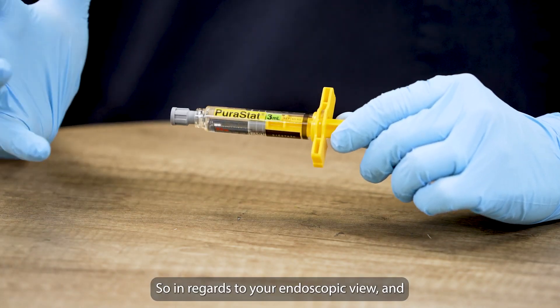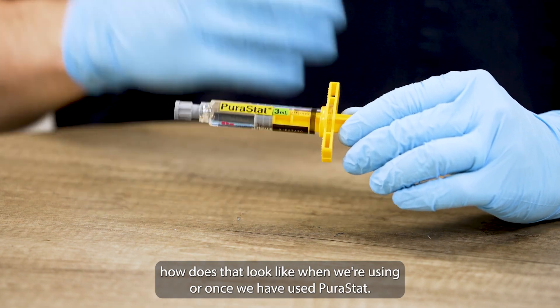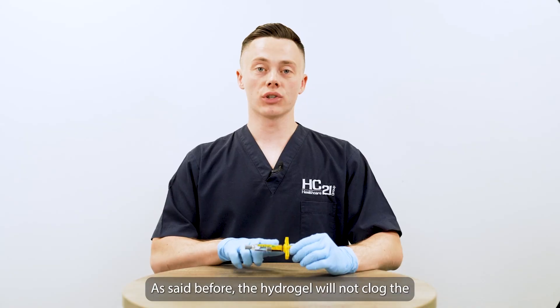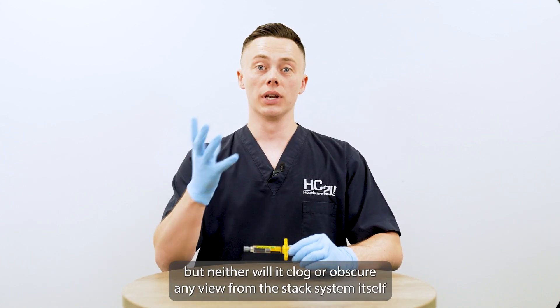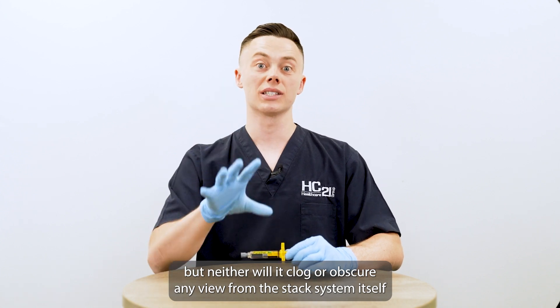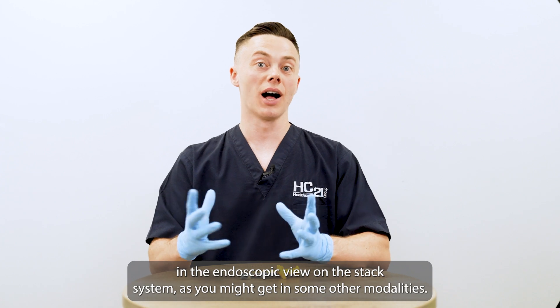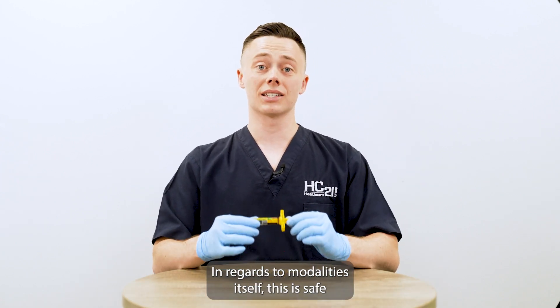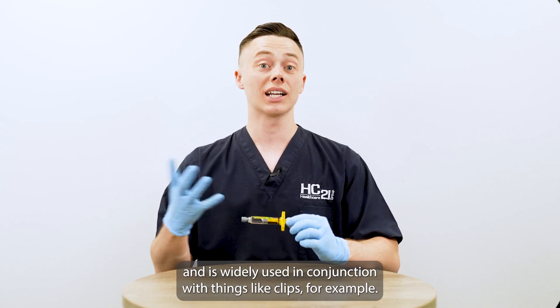In regards to your endoscopic view and how that looks when we're using or once we have used PuraStat — the hydrogel will not clog the endoscope itself or the working channel, and neither will it clog or obscure any view from the stack system itself and the endoscopic view on the stack system, as you might get with some other modalities. In regards to modalities, this is safe and is widely used in conjunction with things like clips, for example.